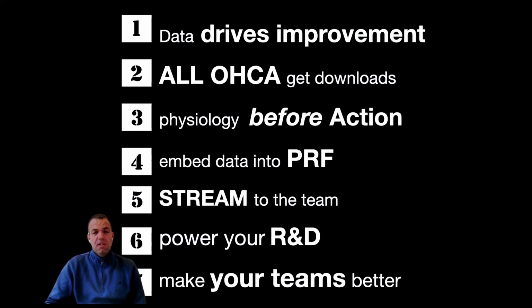Personally, I think every resuscitation attempt should get a download. You should look at the quality of resuscitation, how deep you're pushing, how quickly your chest compressions are going in, your time to shock, and then feed that back to crews so that they can do better the next time. We really want to be striving on a service level to high quality cardiac arrest resuscitation care.